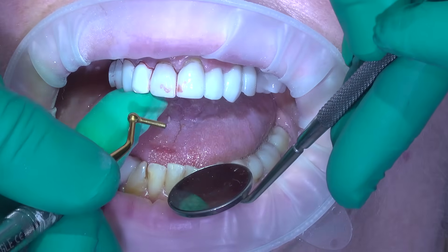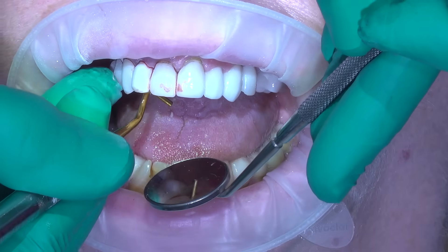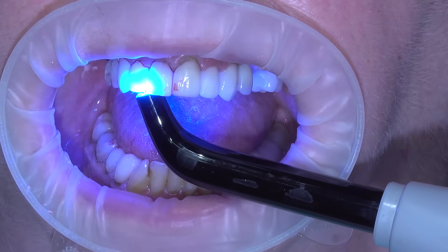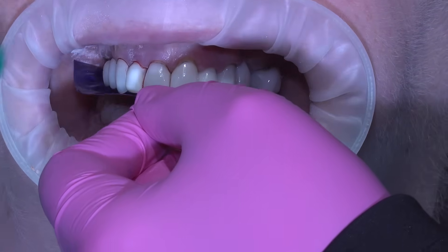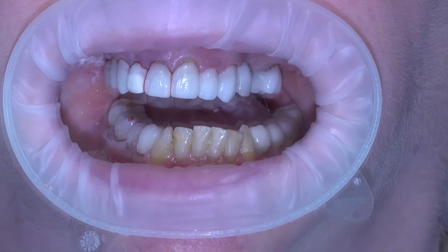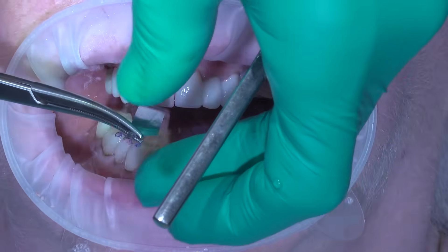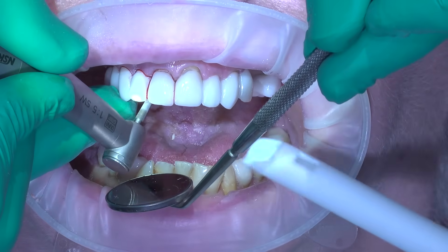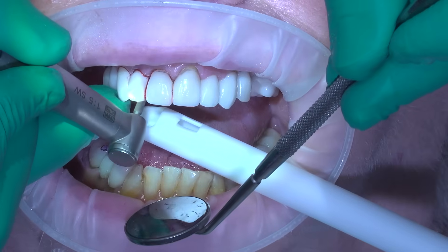A little bit of the yellow PTFE went in the hole, and then some composite. Remember, the two main purposes here are: socket sealing — the provisional is sealing in the graft around the area — but more importantly, what we've coined as 'maintain, not regain.' I want to maintain all the hard and soft tissue architecture around my site so I don't have to grow it later. And this is also where I noticed she didn't have the shim stock holder, so I asked her to go grab it, and while she was running off, I improvised with my hemostats — it makes assistants feel good when they come back and you're already done. A little bit of polishing on the composite filling the access hole.